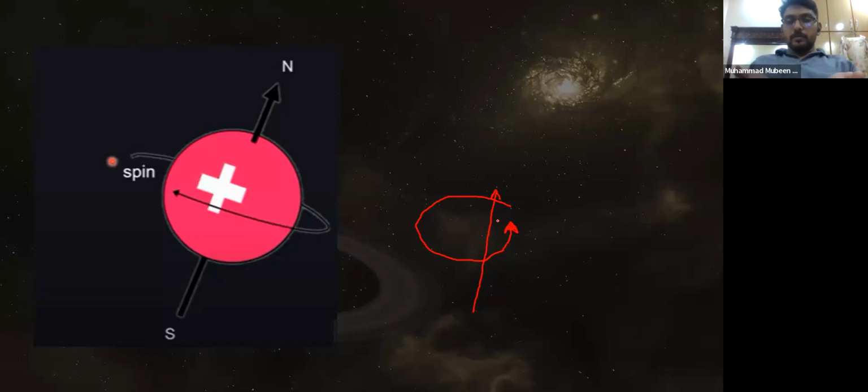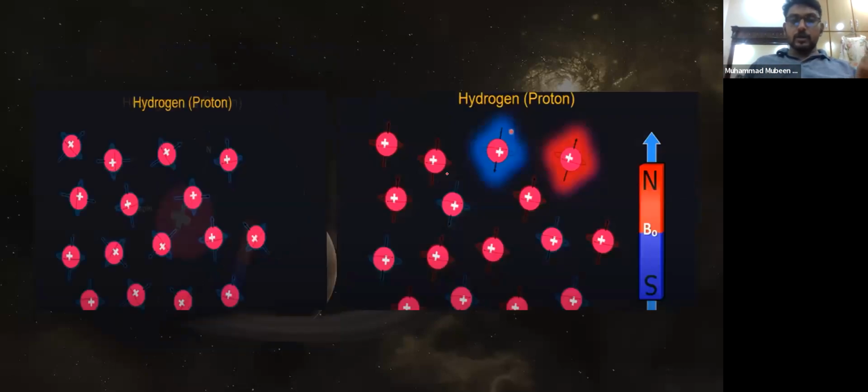So what happens when a positively charged nucleus moves? It creates its own electromagnetic field. Whenever a positively or negatively charged particle moves, it creates its own electromagnetic field. That is a factor that is utilized in an MRI to create the images. Now, we have an abundance of these charged particles in our body. Normally, in a net neutral condition, all these nuclei are moving randomly in all different directions, so the net effect on our body is zero magnetic or electric effect. We don't have any magnetic charge or any magnetic field.